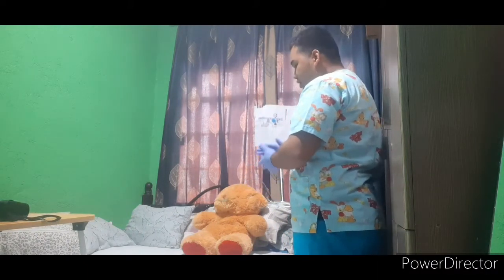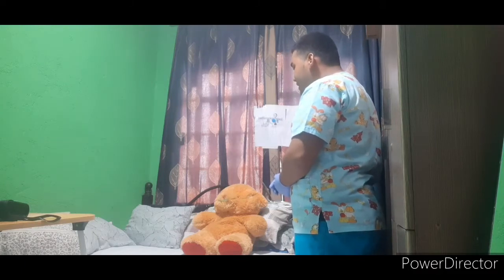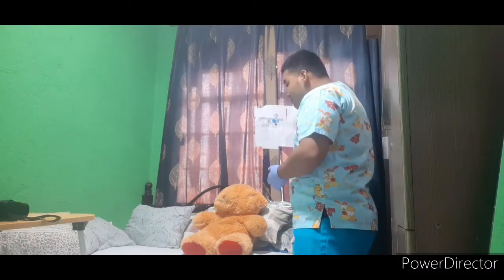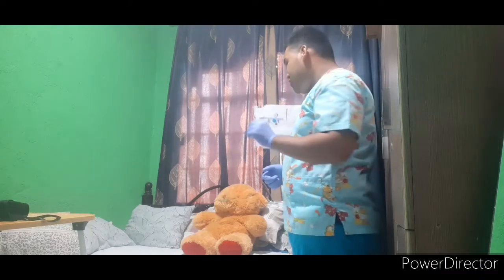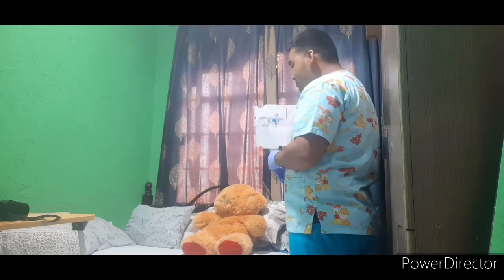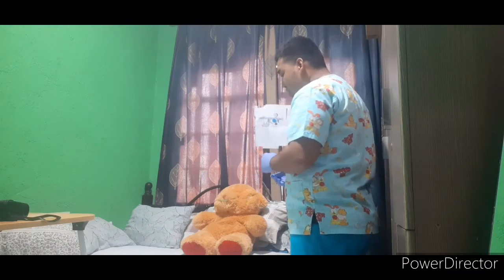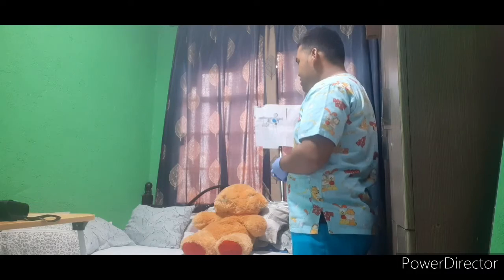Good morning ma'am, I am Christopher Pejo Leliza and I will be your nurse for today. May I know your name ma'am? Okay, and your date of birth? Okay, November 30, 1985. So for today's procedure, you are going to undergo naso-oropharyngeal suctioning. We are going to use a thick tube — it will be a little uncomfortable — which we will insert into your nose and your mouth. This procedure will help improve your breathing and make you more comfortable, as we will suction the mucus and saliva from the back of your throat. Is that okay? Okay.